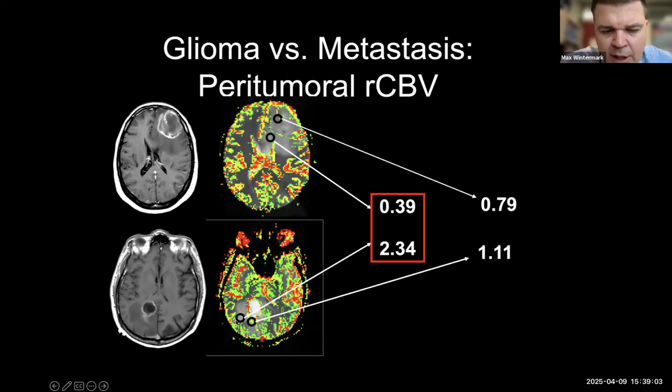Whereas for that second patient, when you interrogate the area of abnormal FLAIR, T2 signal surrounding the area of enhancement, you can see that the cerebral blood volume is actually increased. And that suggests that it's not just plain vasogenic edema, but that you have a little bit of tumor perfusion, even if it's not enhancing, and therefore it pushes you towards the diagnosis of primary glial tumor.